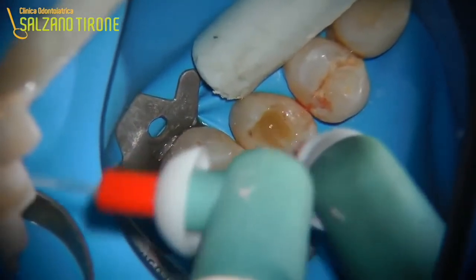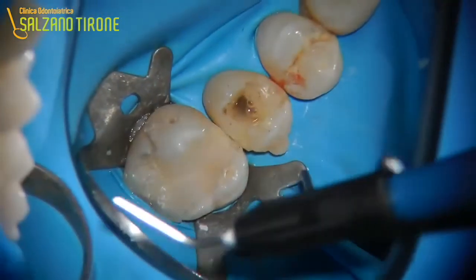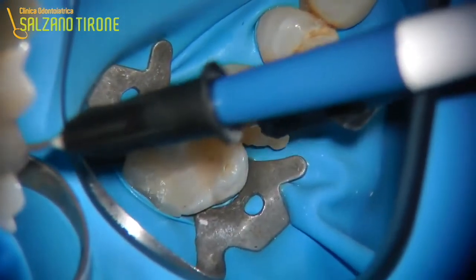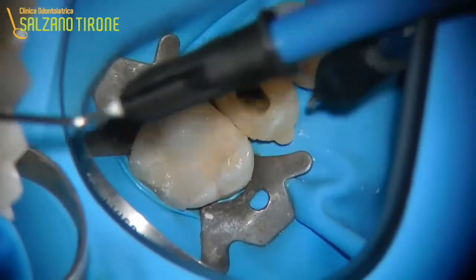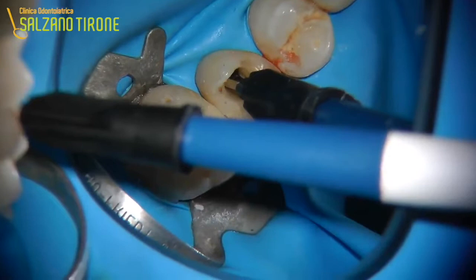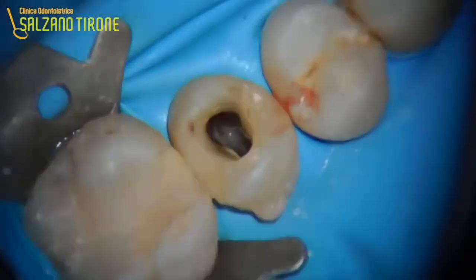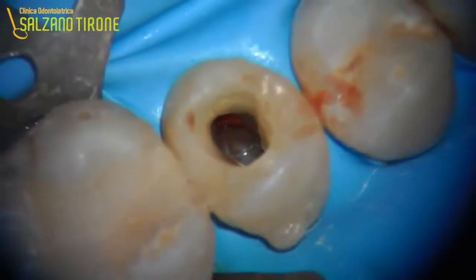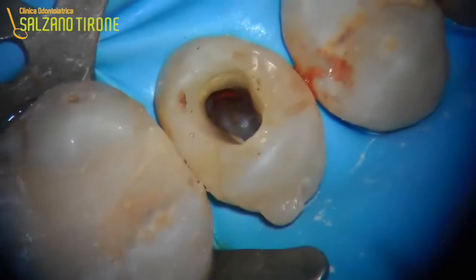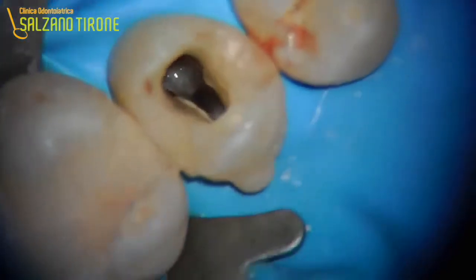Here you can see that I'm putting a little tip for composite to clean well into the defect, otherwise you'd have to roughly suction everything out and it would really get on your nerves. Once you have cleaned all the defect with some microcurette, you realize that there are some undercuts which prevent you from seeing the defect well. Therefore, we can widen it with some turbine bars. With the microscope, you are fully in control of what you are doing.